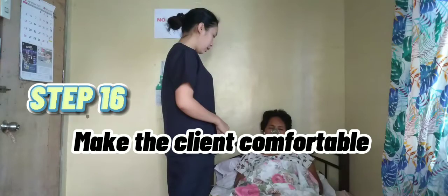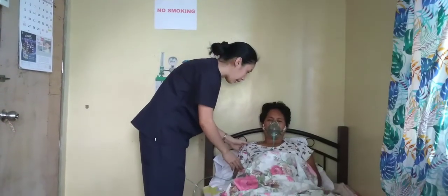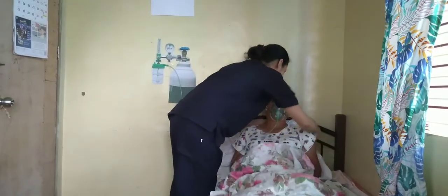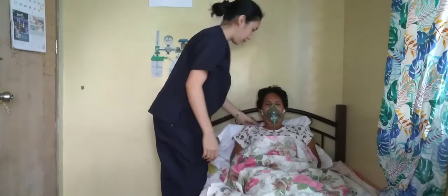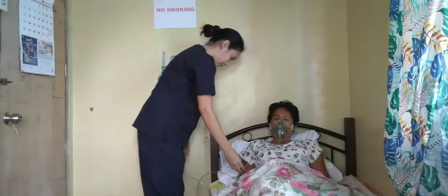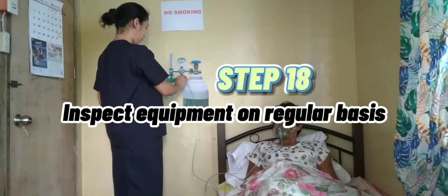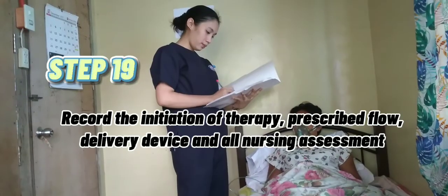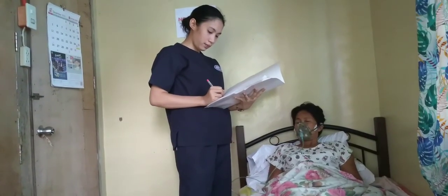Step number sixteen: make the client comfortable. Step number seventeen: assess the client regularly depending on the client's condition. Inspect equipment on a regular basis, check the liter flow, and maintain the water level in the humidifier. Lastly, document all relevant data — record the initiation of therapy and all nursing assessments.